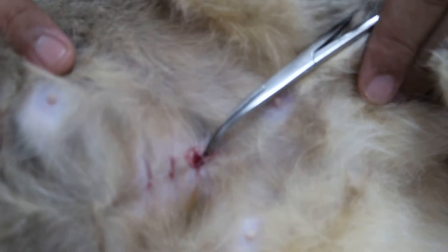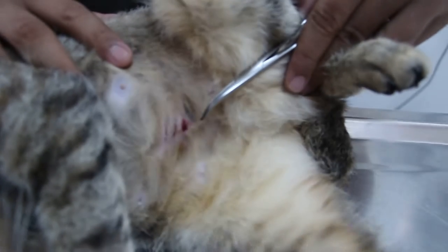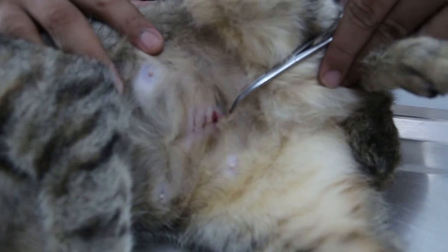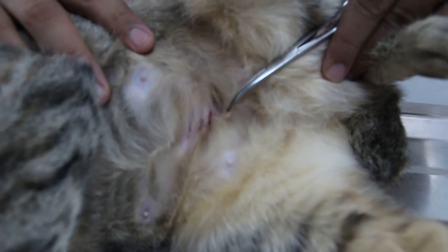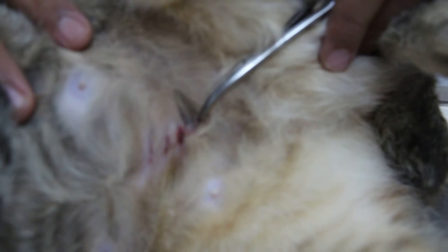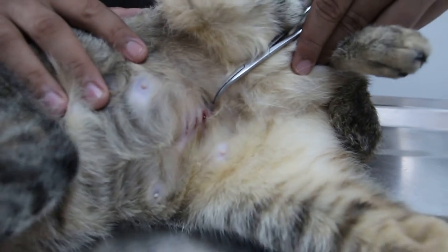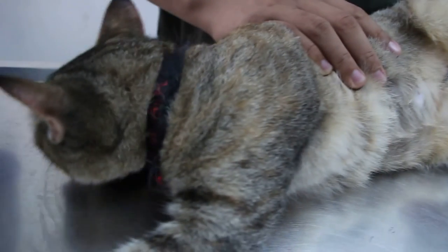The owner has delayed — normally 14 days will be the best time to take out the stitches. Even though they're absorbable, this Monosin 3-0 does not dissolve even after 30 days, and so we always ask the owner to come back if the stitches are still around.